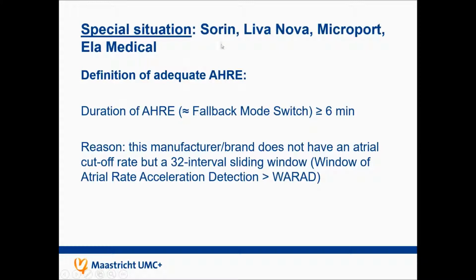A special situation is for the manufacturer Sorin or LivaNova or MicroPort or ELA Medical. There we have another definition of an adequate atrial high rate event, and that's just when the fallback mode switch is longer than 6 minutes. And the reason for that is that this specific manufacturer does not have an atrial cutoff rate that you can program, but it has a sliding 32 interval window in which it continuously is measuring the atrial rate and then activates the mode switch. So for this specific manufacturer, we use another cutoff rate.